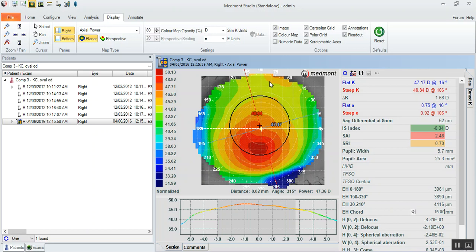Now this is a keratoconic patient, so clearly in the more bulging and irregular eyes, we want to favor the larger diameter. Bigger diameter, bigger vault over that irregularity. So we've set the chord at 15 millimeters, and we look up here at the estimated height across the 0, 180 meridian. And it's coming up as 3,960 microns, or 3,961 microns.